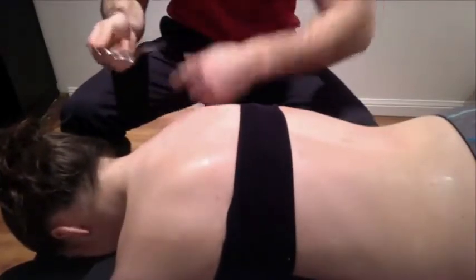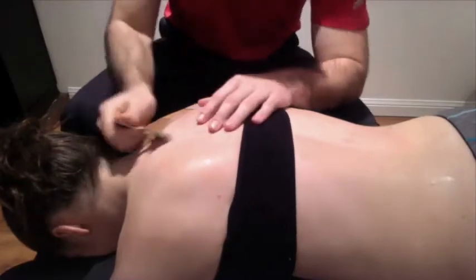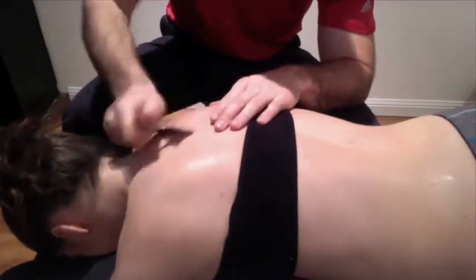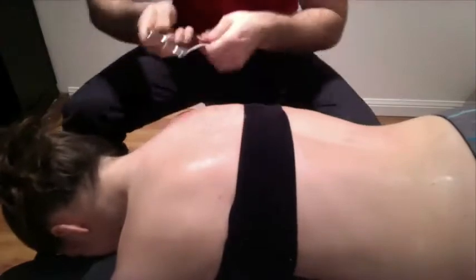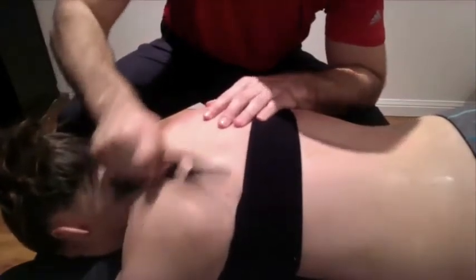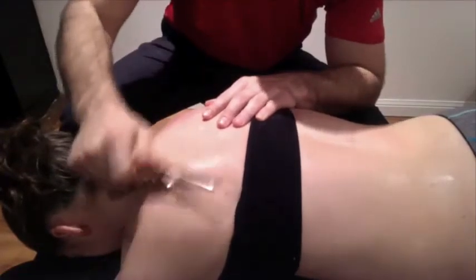So again, we're going to start off with our number one edge, this one right at the bottom here. And we're going to use it to kind of feel for any of those superficial, bigger restrictions or adhesions. And we're going to check out both sides, always trying to keep this on a 45-degree angle so that we're not just pulling on the skin.